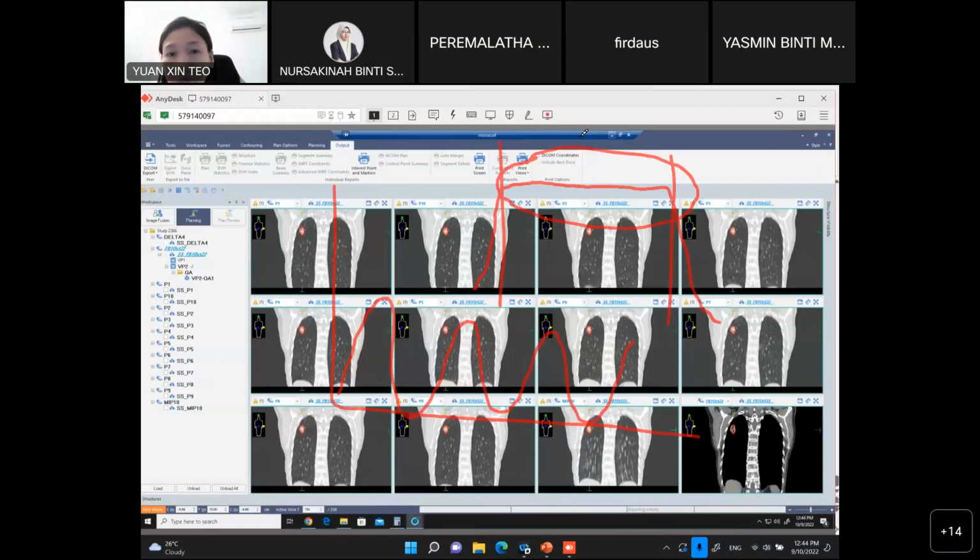Okay, but after we try to train this patient to hold the breath for at least 20 seconds, there is a criteria to set how deep you need to breathe in. This patient is a 60 years old patient. Unfortunately, she can't hold her breath until the target reset.